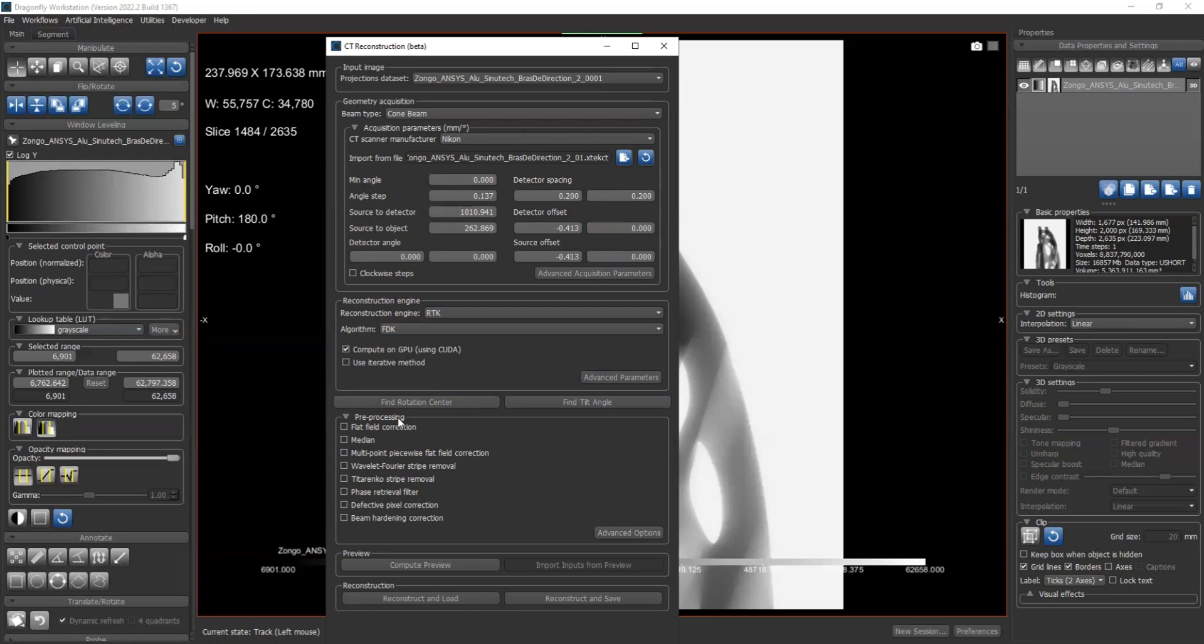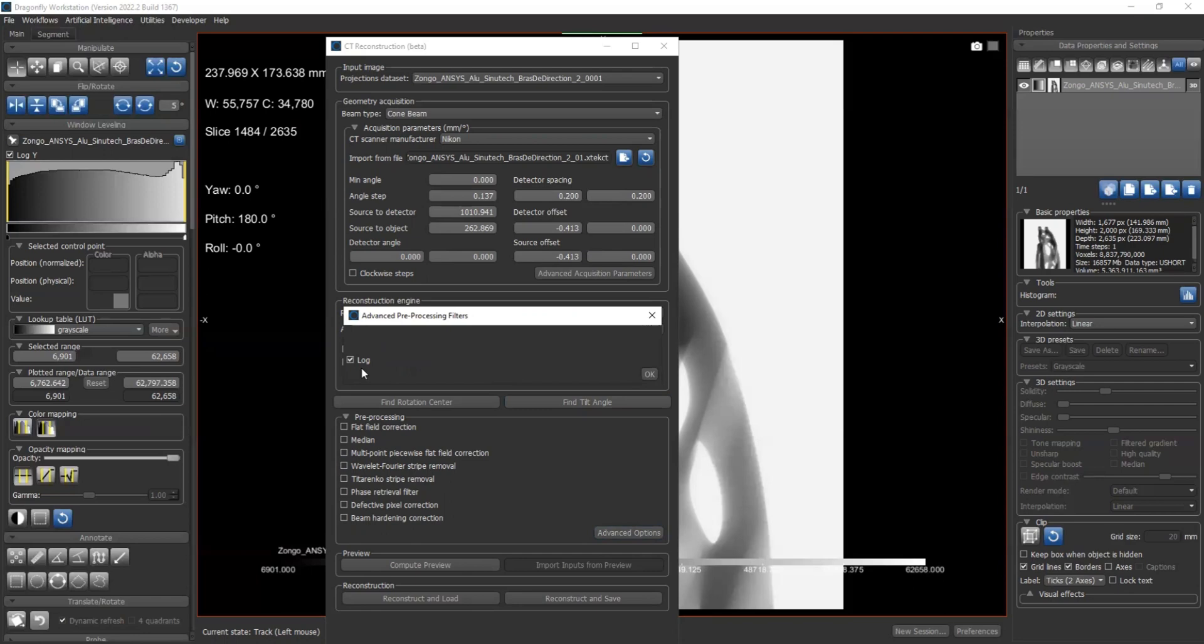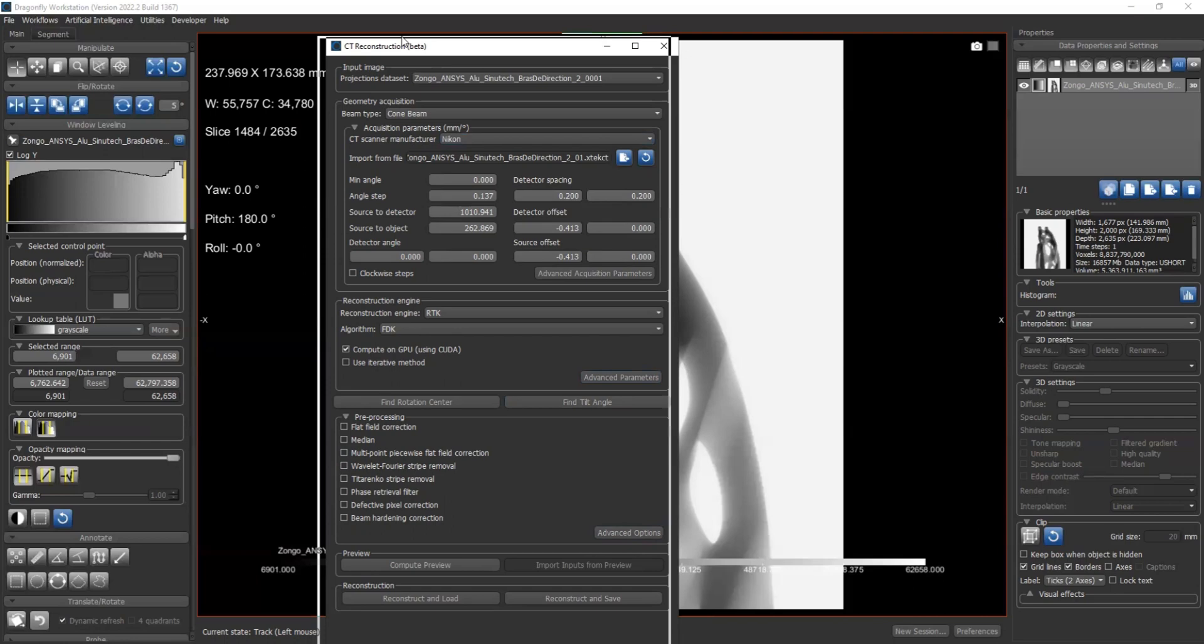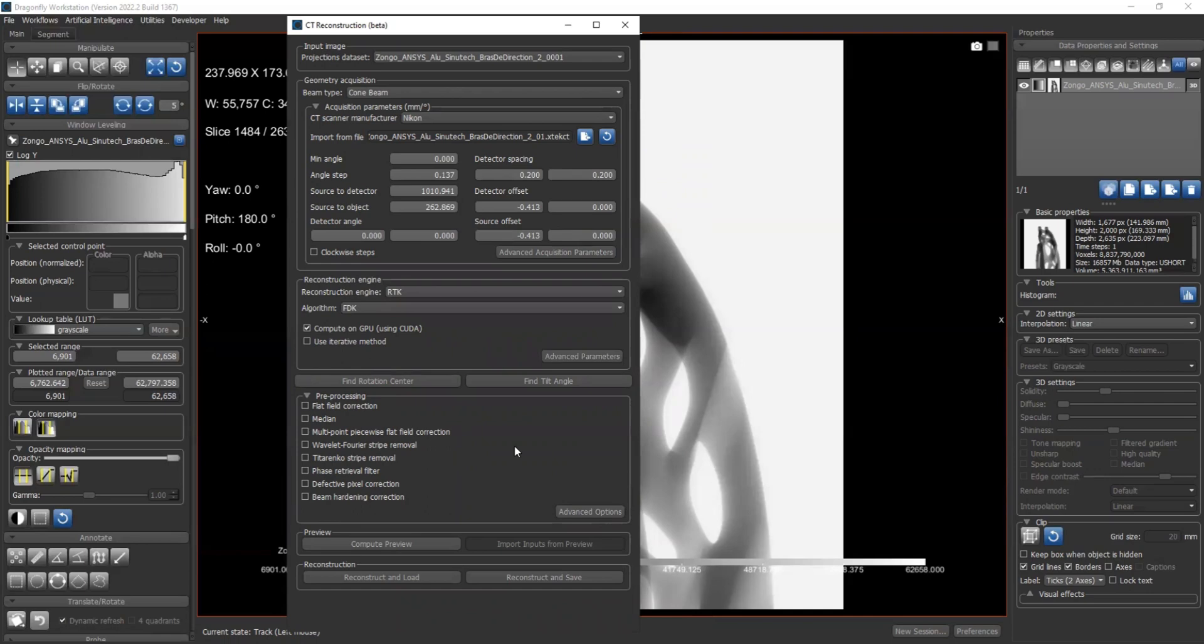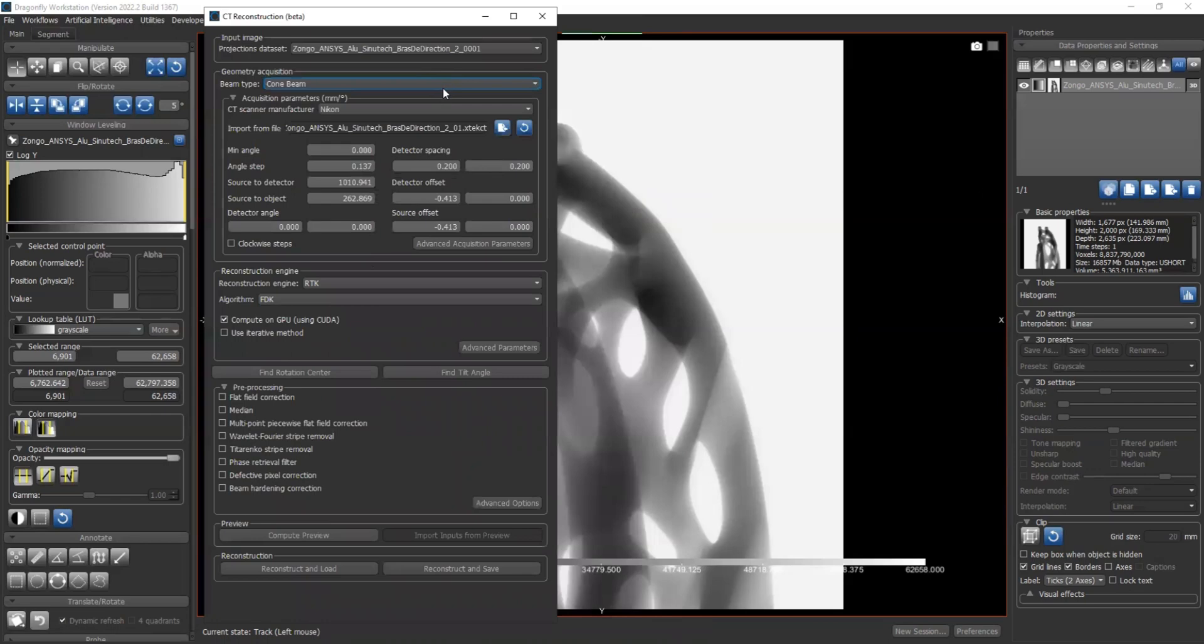Next, we can select what kind of preprocessing you want. We have different options here. By default, in the advanced options, the log filter is selected because typically the projection we got, the background is brighter than the feature part, so we need to apply a log filter to have the correct image. But if your projection has been log filtered, you may need to uncheck this log filter here. Again, there's so much information in the preprocessing part, so I will have another video talking specifically about each of these preprocessing filters. I'm going to skip this part for now.